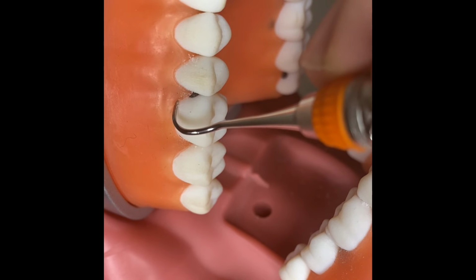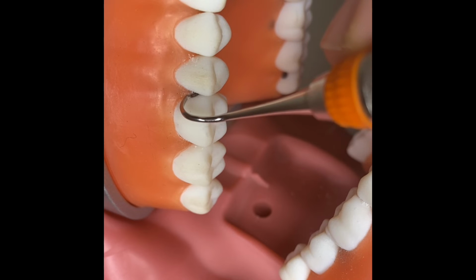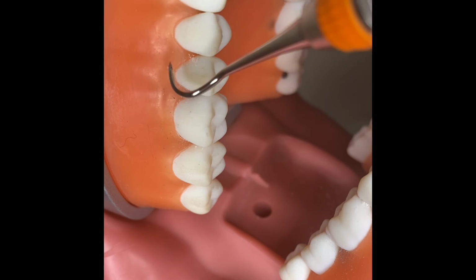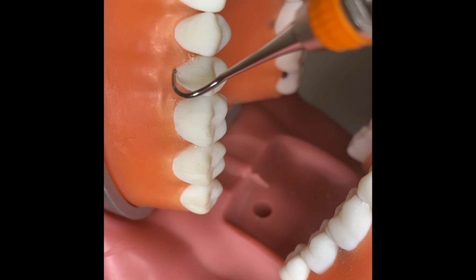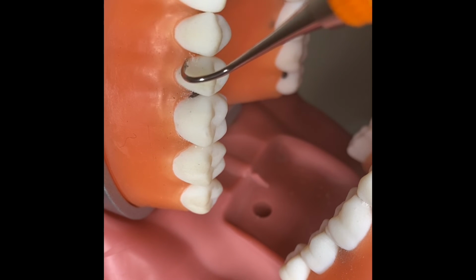Side to side, pivot, roll, up, down, down. Number 4, side to side, pivot, roll, up, down.